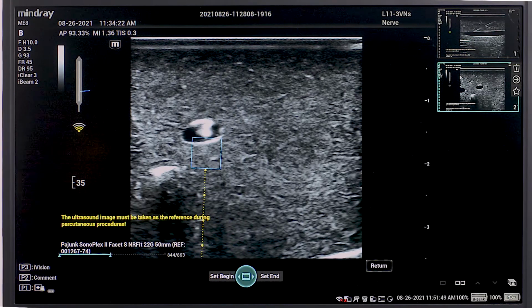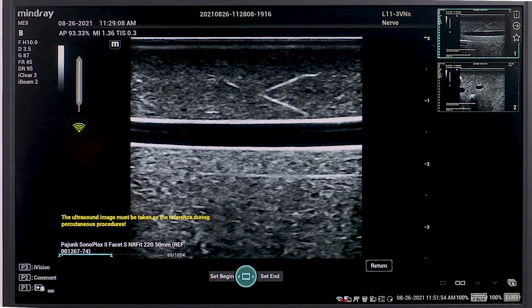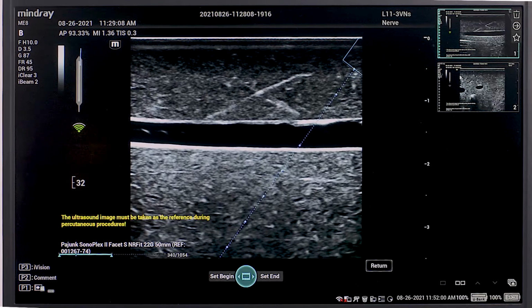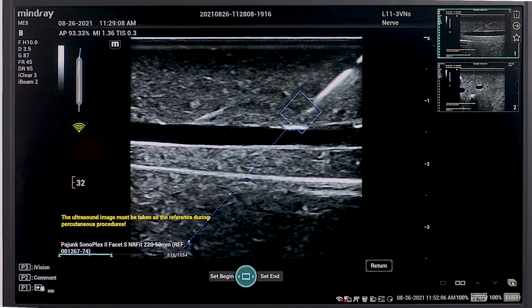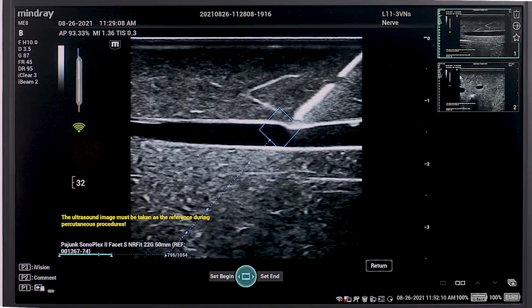For in-plane procedures, the colors mean the same. Once the box is blue, the needle is in plane with the ultrasound beam. Light blue means the needle is close to the beam, and orange has fallen out of the beam. Notice the graphic at the upper left of the image, which shows the needle orientation in relation to the ultrasound beam.